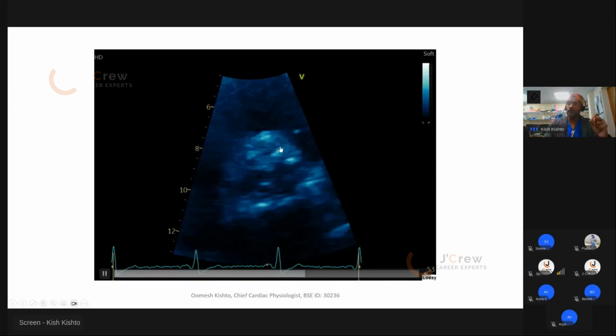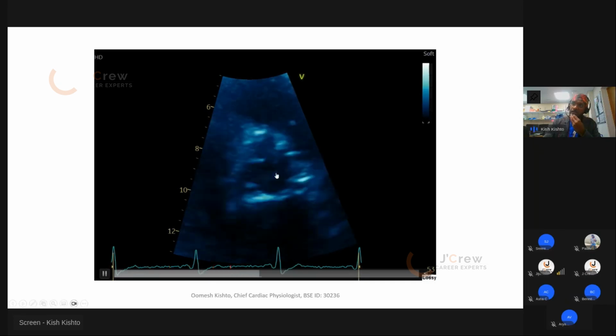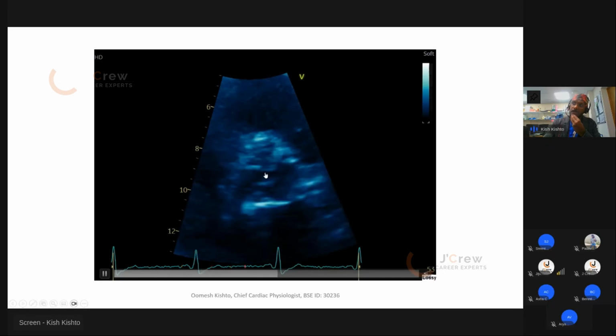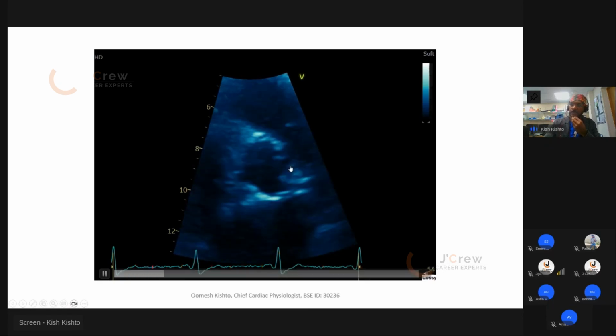So you're saying that the non-coronary cusp appears mobile but restricted. The tip is moving, as you can see, but the basal part of the aortic valve is not. Only the tip is moving there, and the left coronary cusp appears fixed.